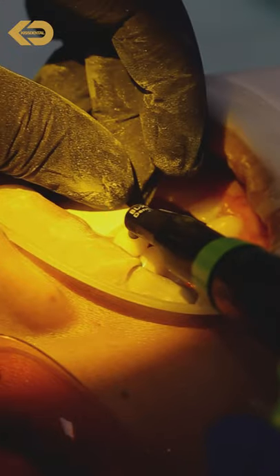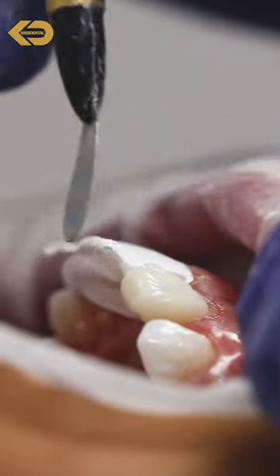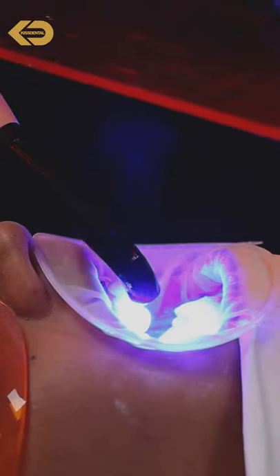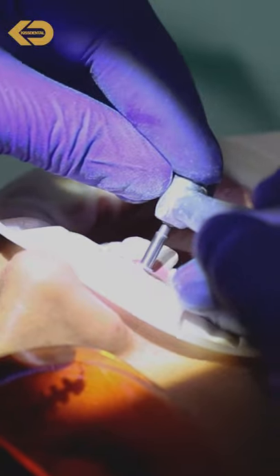After choosing our shade, we apply the composite material and begin sculpting it around the tooth. To set the composite in place we cure it for around 10 seconds. If we are happy with its placement, we then polish the new composite, giving it a smooth finish.